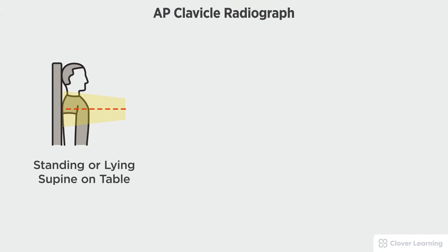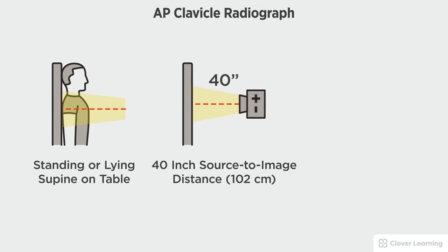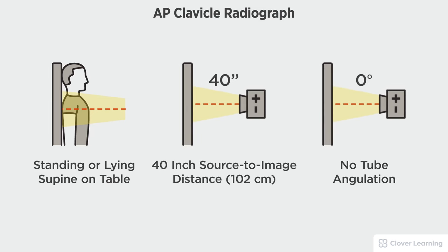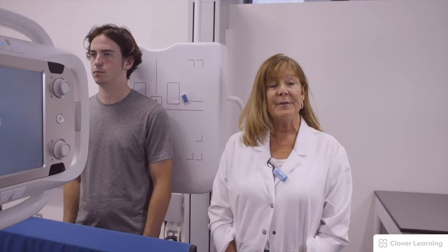In this view we will be demonstrating the AP clavicle. The AP clavicle should be performed with the patient standing at the upright bucky or lying supine on the radiographic table with a 40-inch source to image distance and no tube angulation. For the first view, the AP, we are going to use a 40-inch SID.